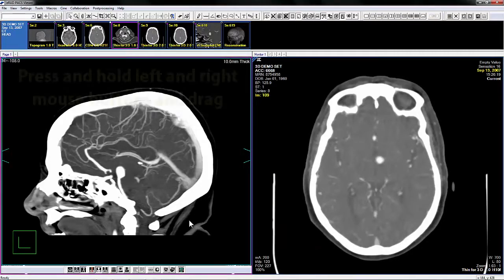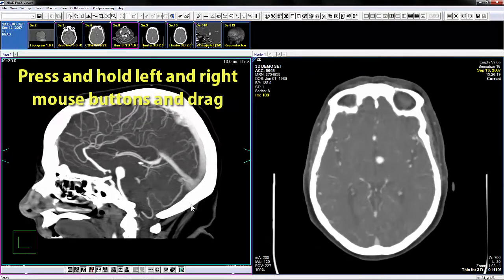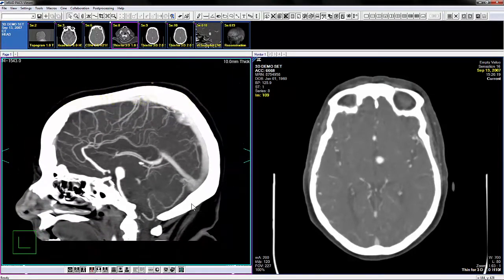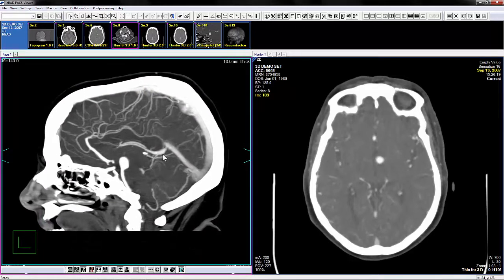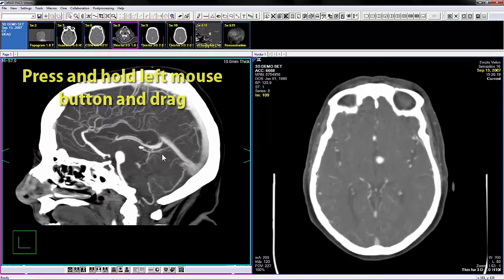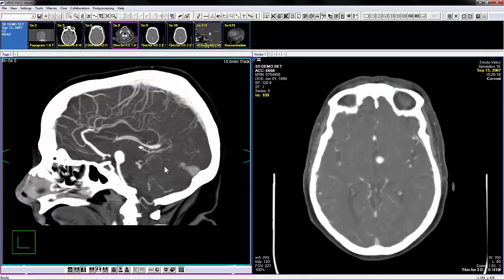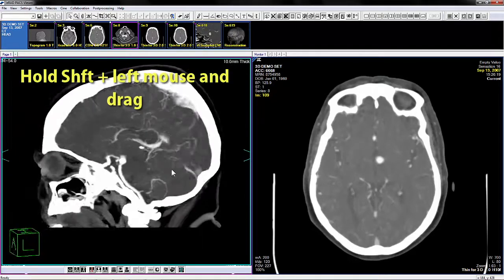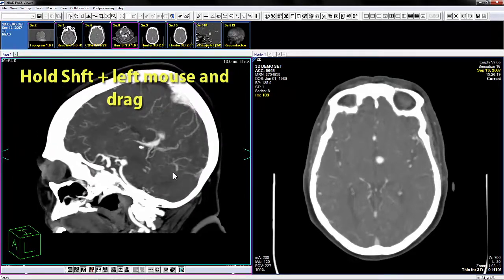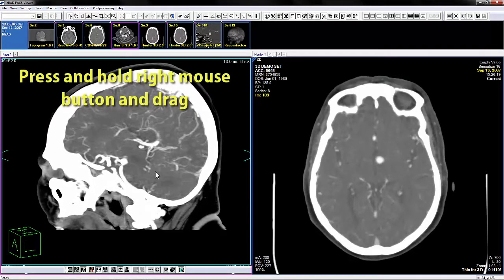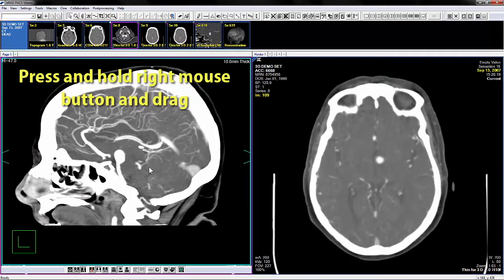To dynamically zoom the image, press and hold both the left and right mouse buttons and drag the mouse up and down. To pan or reposition the image, press and hold the left mouse button over the image and drag the mouse. To rotate the volume, press and hold Shift and the left mouse button, then drag the mouse. To adjust the window level, press and hold the right mouse button, then drag the mouse.